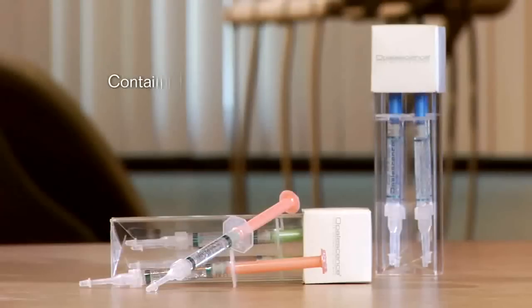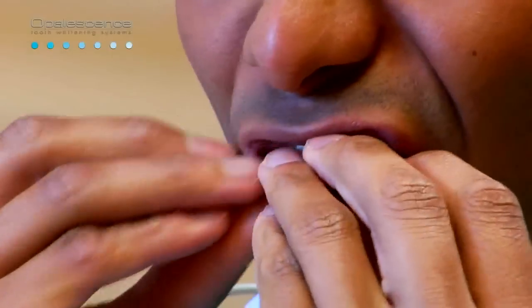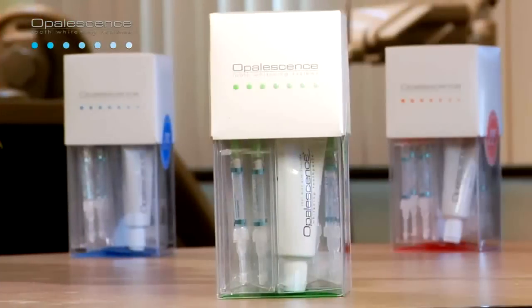Opalescence comes in 4 concentrations: 10, 15, 20, and 35%. Lower concentrations are worn for longer periods of time, or patients who are prone to sensitivity may use them. Higher concentrations can be worn for less time. This choice in concentrations demonstrates a continued dedication to providing patients with the widest smiles possible without compromising comfort or safety. Additionally, Opalescence is great tasting, flavored in mint, melon, and regular.